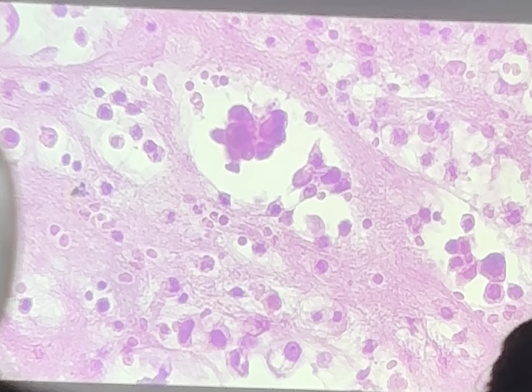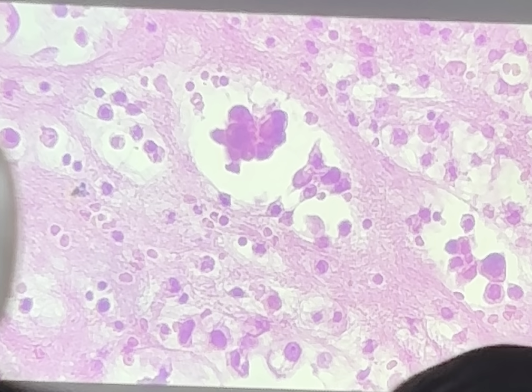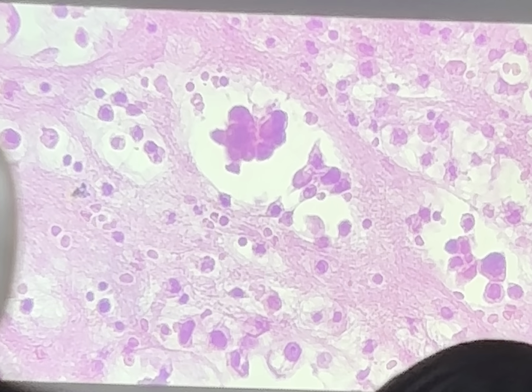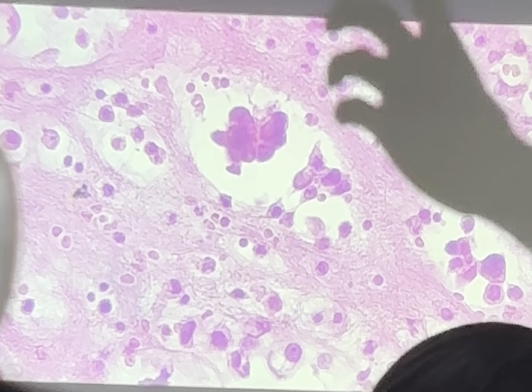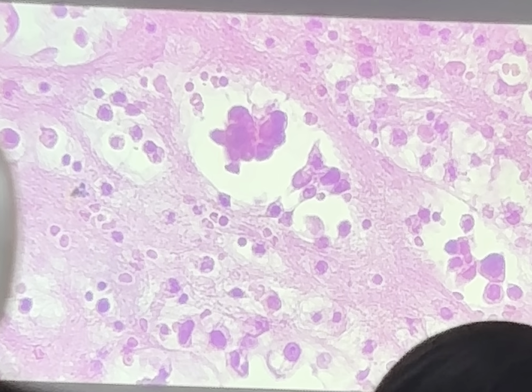So you see this in a malignant pleural effusion. Okay? Most likely this came from an adenocarcinoma because it's vaguely forming glands. So when we say gland, it's adeno. And then it's cancer, carcinoma, adenocarcinoma. If it's benign, adenoma. Okay? So this is probably from a metastatic adenocarcinoma. That's a pleural fluid.